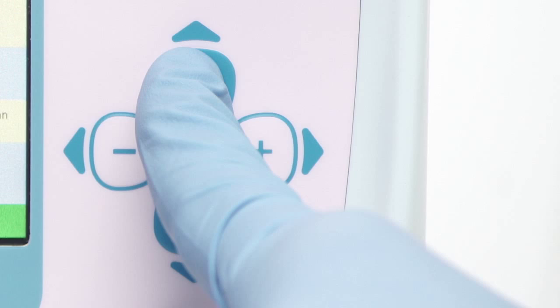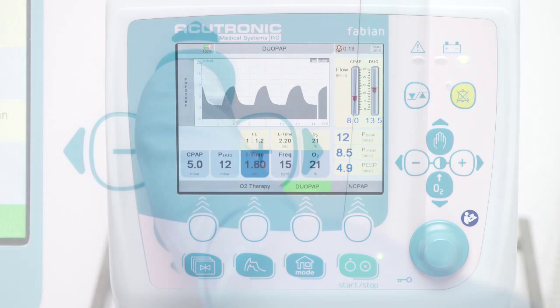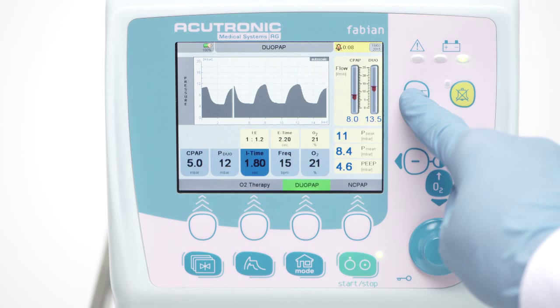The alarm limits are set in a dedicated menu, which is selected by pressing the alarm limits button. The alarm limits must be set after the ventilation parameters have been set and stabilized.